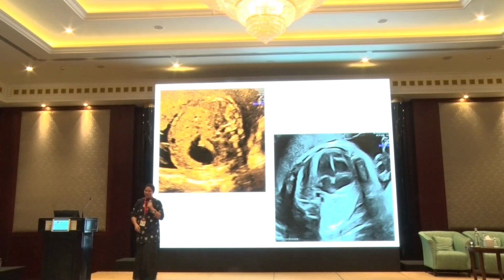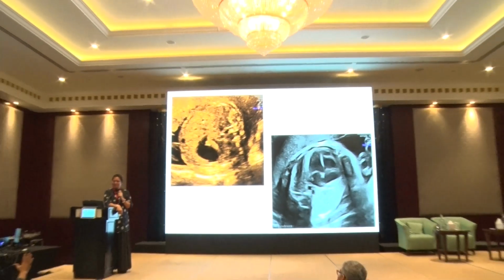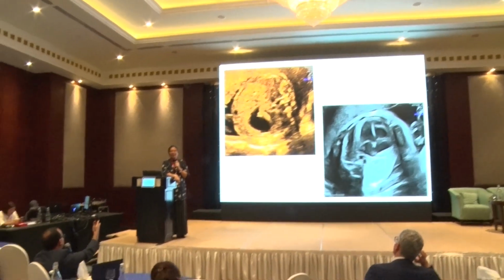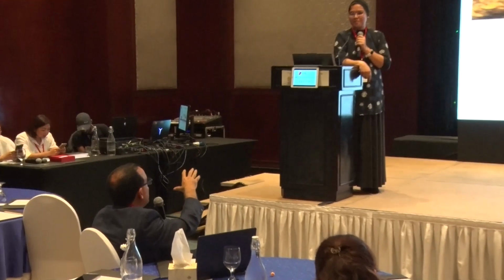Can I comment a little bit? Yes, please. Just to make it more interactive with all of us. When I see this view, again, what's the problem with it? Number one, we have to make it live. Now, when you make it live, what you said is absolutely true. But how can I convince the rest of the population around me this is true? Dr. Suleiman, the images were deleted from the machine before I could retrieve them. I got it from PACS, and there are no live images.